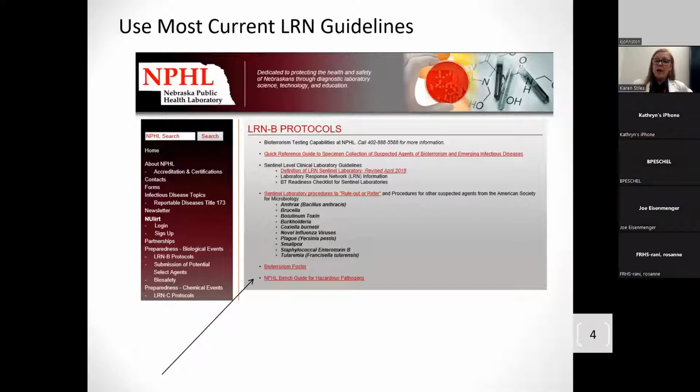So I realize that in the state of Nebraska, many of our laboratories don't carry a whole lot of old conventional biochemicals. That is why every 6 months you get the shipment of the motility and the urease. And if need be, let me know, because I can also provide some of the other things. Most labs have oxidase, have indole, but you might not have beta-lactamase. So let us know what you do have and what you don't have, and we'll try to make sure that you do have these.